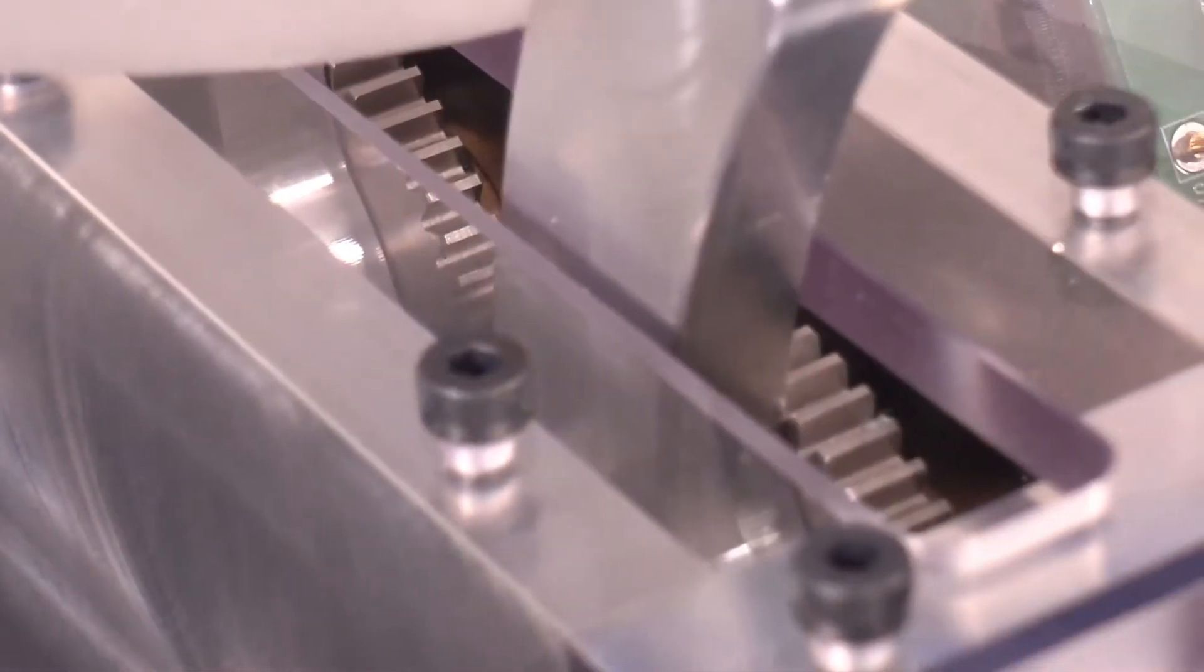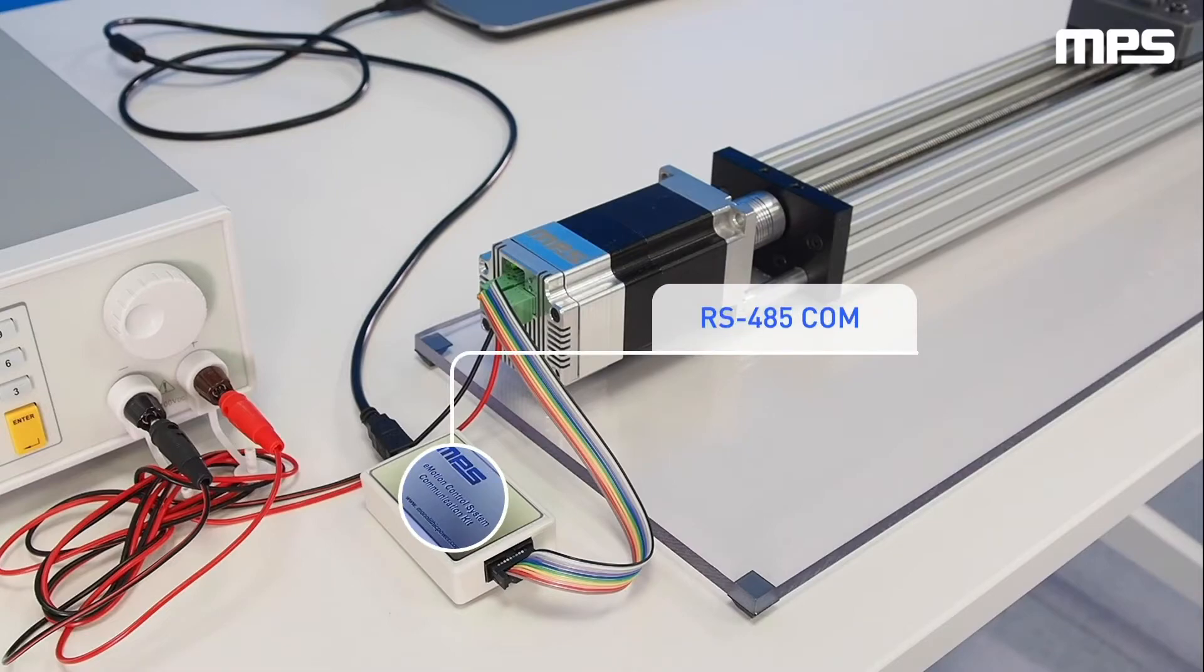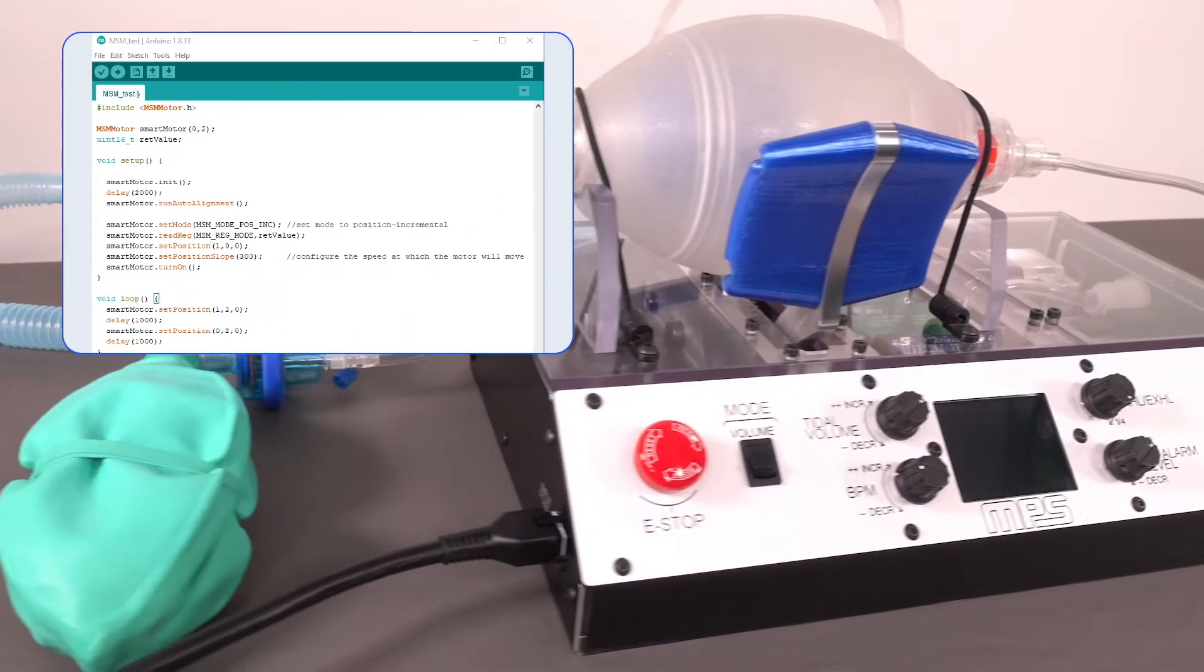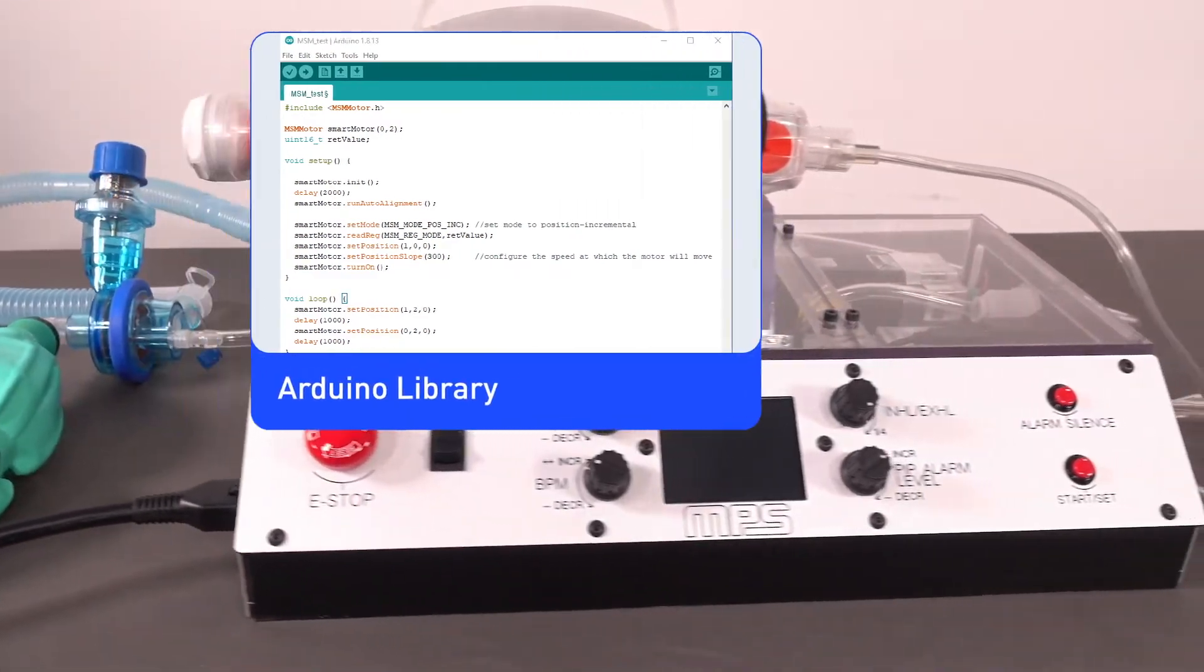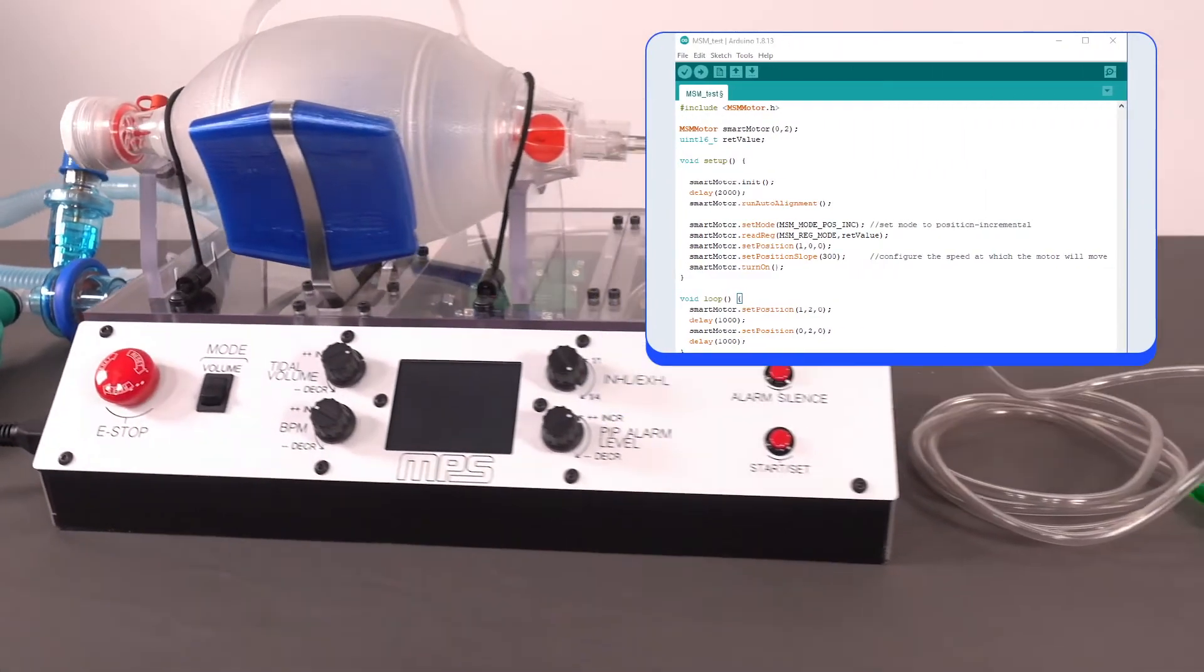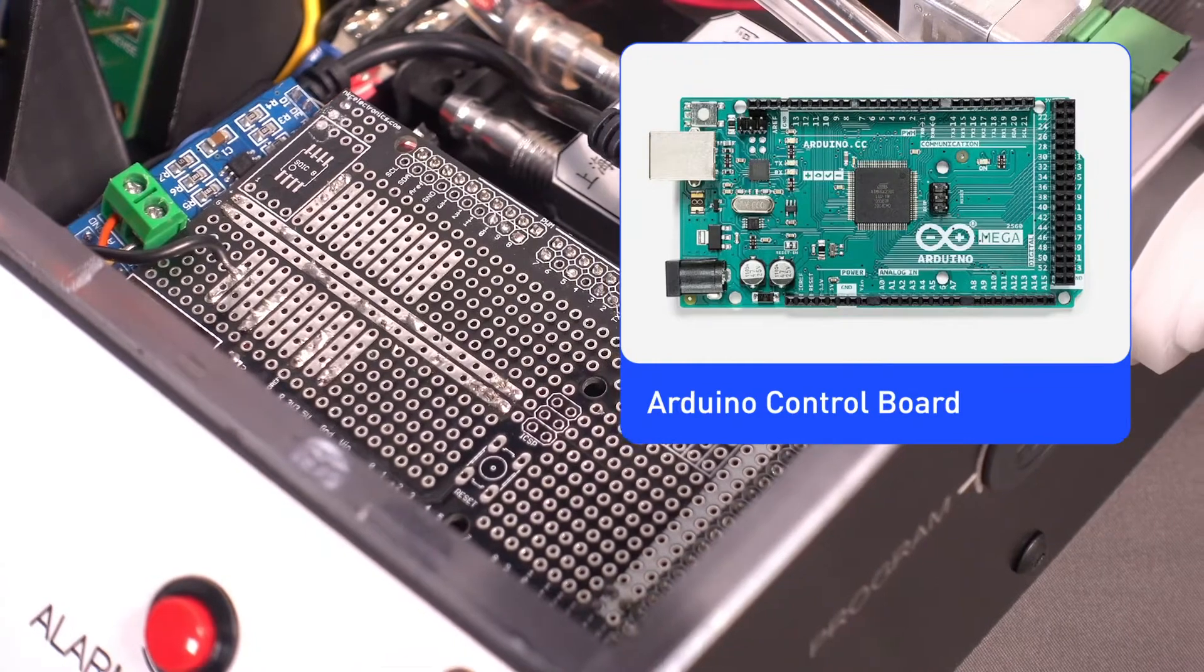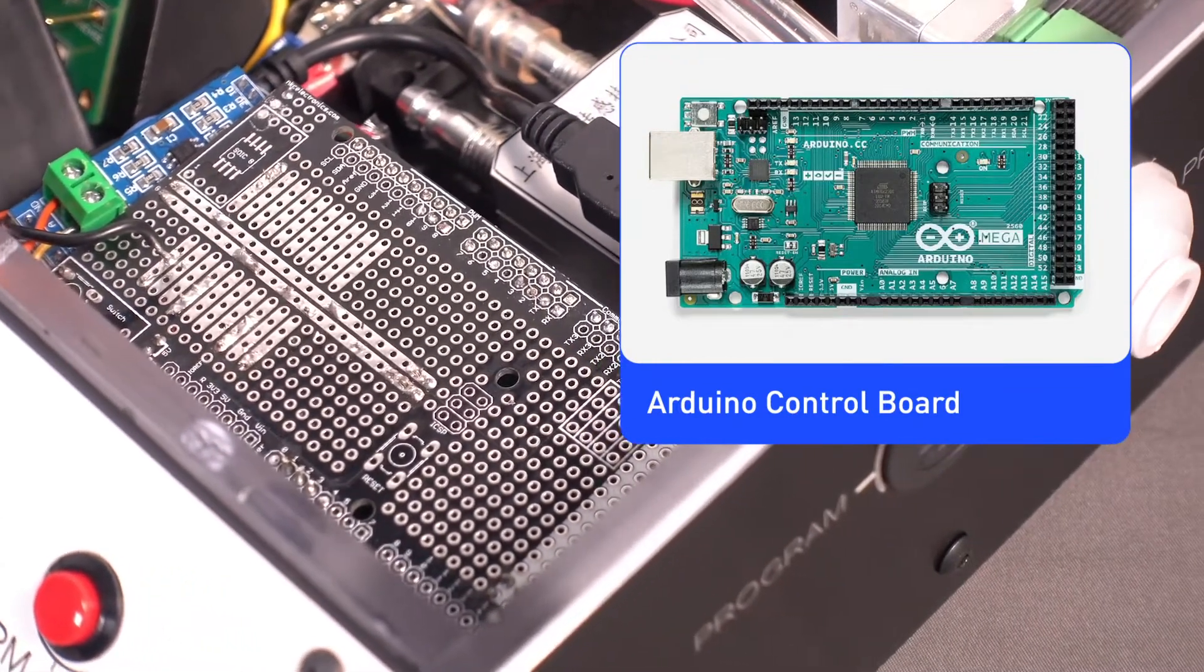Initialization of the MPS smart motor is easily done with the MPS RS-485 communication module and virtual bench environment. On this system, we utilize an MPS-created Arduino library to interface and control the smart motor through an Arduino-based control board with RS-485.